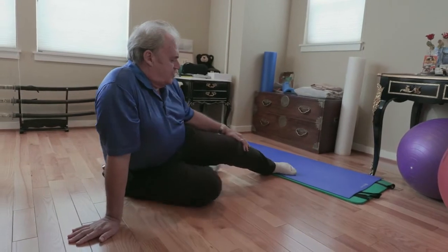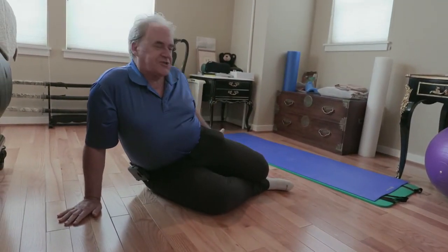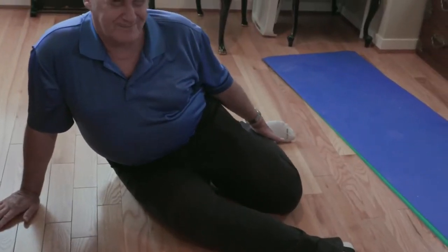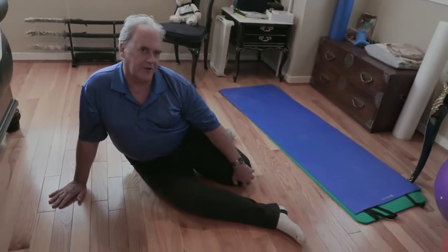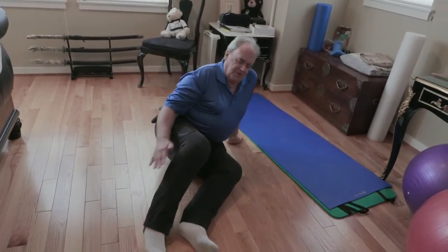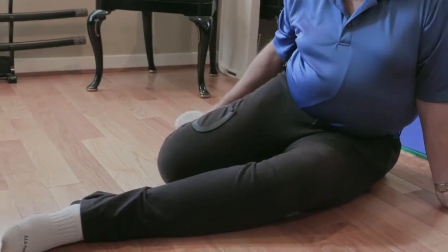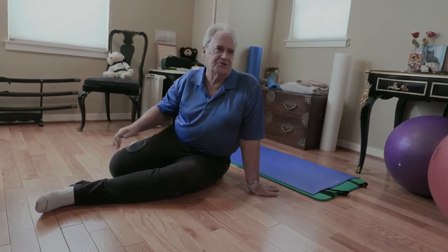This is the off-the-shelf, and that's as far as I can get it. Now, if I grab hold of it, I can bring it up, but then it starts hurting here. Where if I switch to this one, I can have the right one bent as far as I want. I mean, I can bring it up almost to where it's touching my butt.